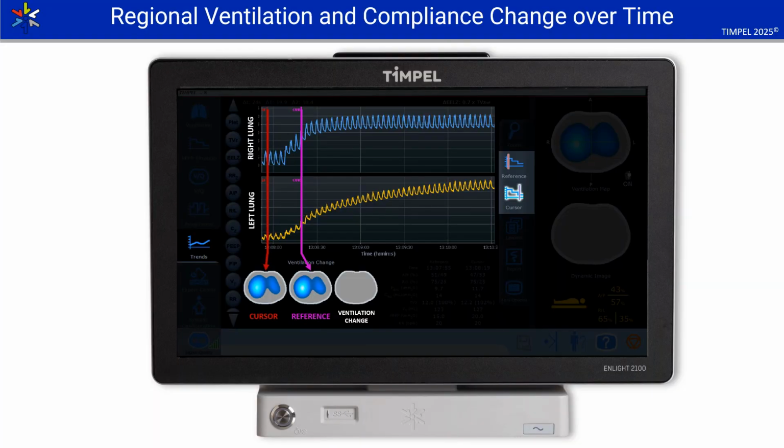With the trend tool, we can analyze and compare two different time points up to 48 hours. What we see here is the effect of increased PEEP, leading to regional lung mechanics changes from a right lung and left lung perspective. The trend is visible on the right and left plethysmograms. On the ventilation change map, green indicates an increase in ventilation, while red indicates a decrease.